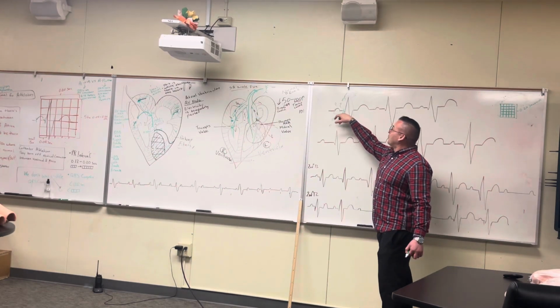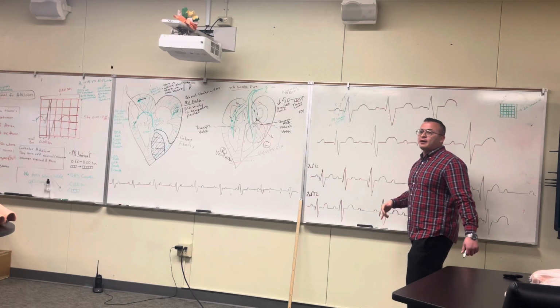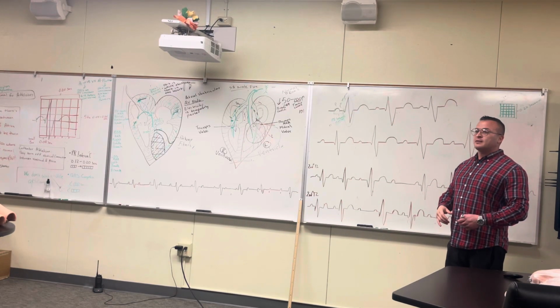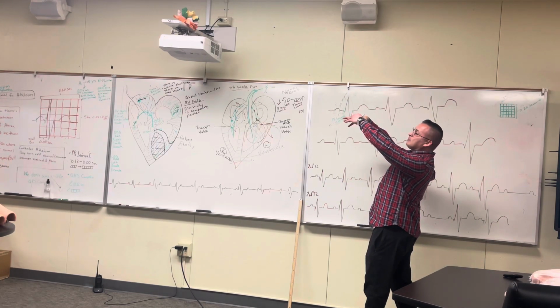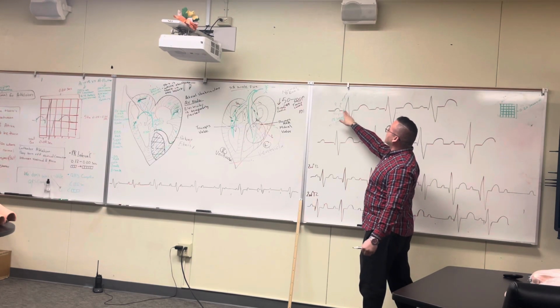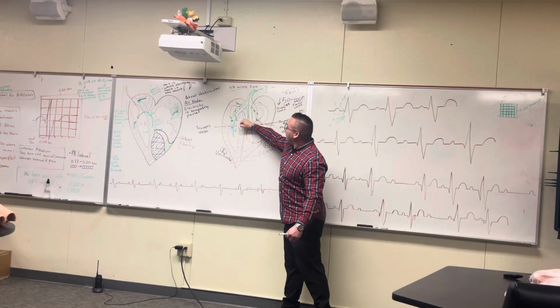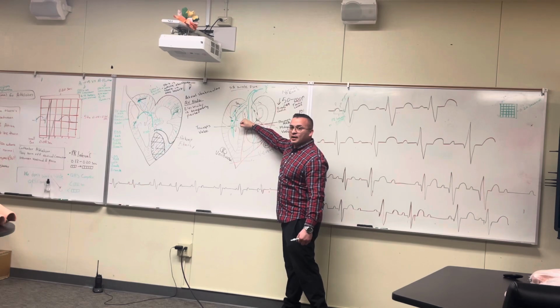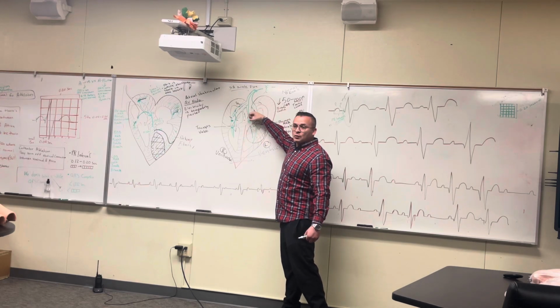And then, Sarah E, what does the QRS mean? What is that telling us? So P wave is SA node firing off, means atriums contracted. PR segment is that electricity pausing at the AV node between the atriums and the ventricles, which allows the ventricles to relax and receive that blood while the atriums are squeezing.